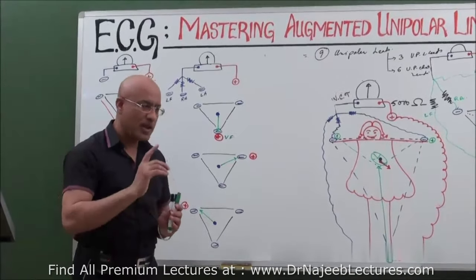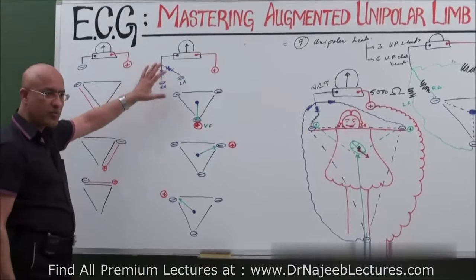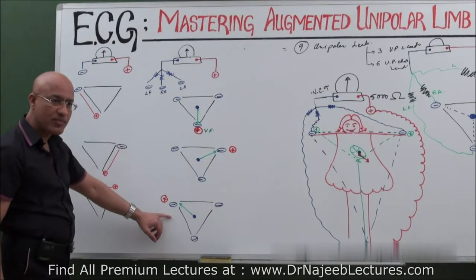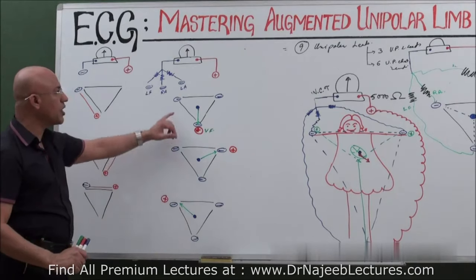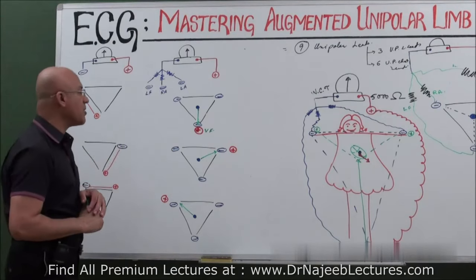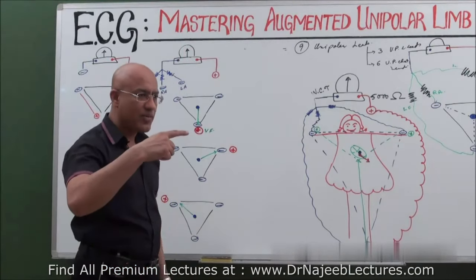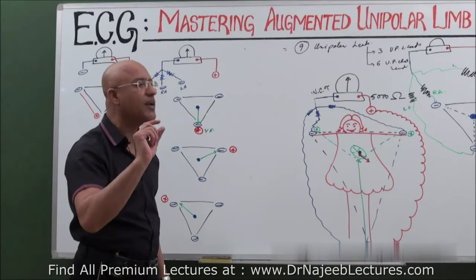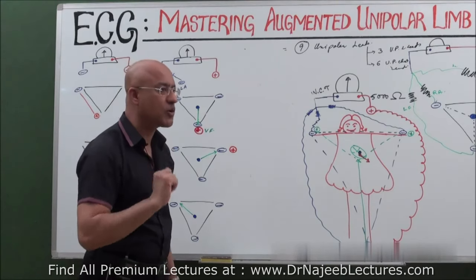There's no question. Now, there was one issue. In the 1930s, Wilson and his colleagues made this system. In this way, they added three more leads, limb leads. Is that clear? And they call them unipolar limb leads: VF, VR, VL. Clear? But there was one problem. The voltage recorded by the machine was very little, so the QRS complex, P wave or T wave were drawn small and were not very readable complexes.